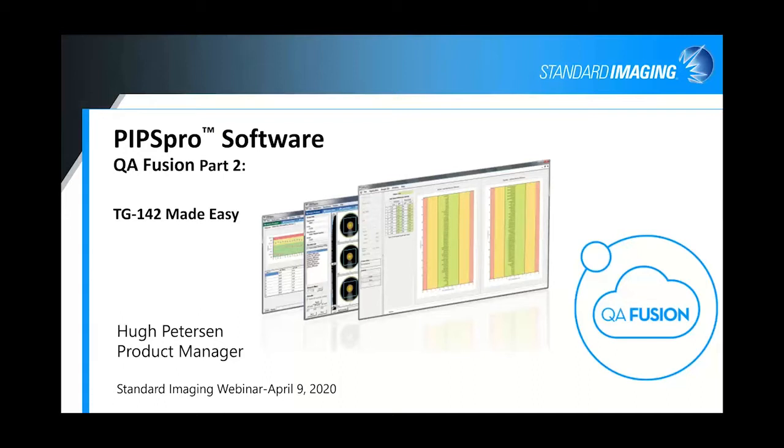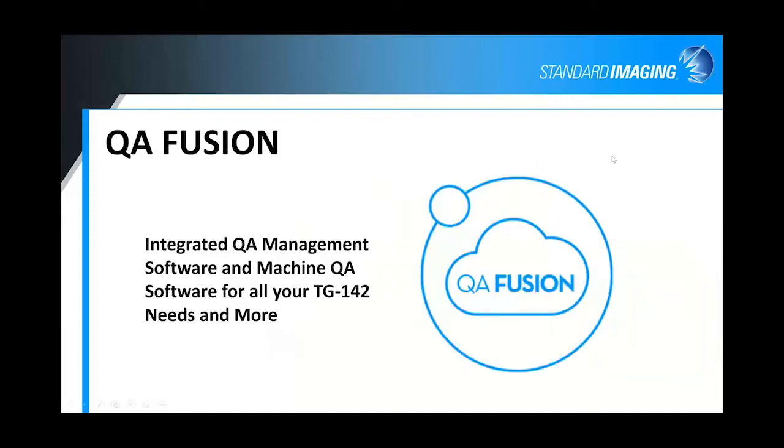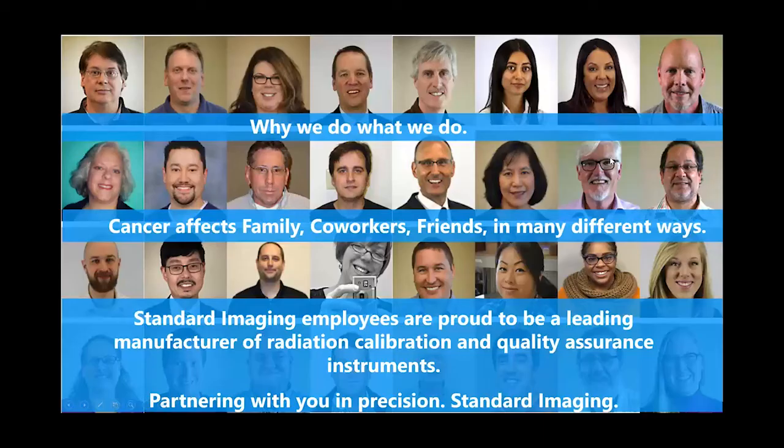So anyway, let's go ahead with today's subject, which is PIPSpro. PIPSpro software is our TG142 software. We like to say TG142 made easy. And just a couple of introductory things, kind of why we do what we do.